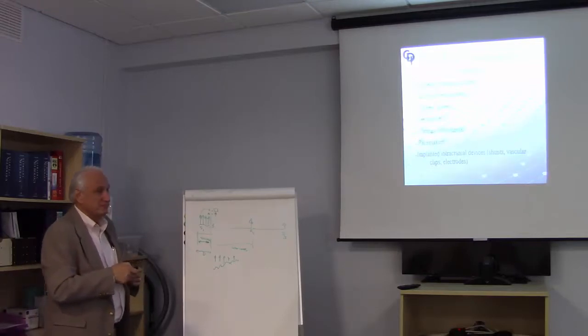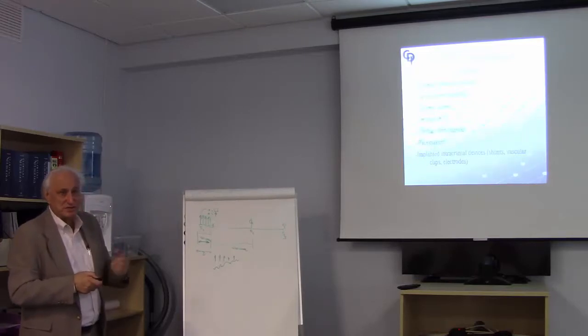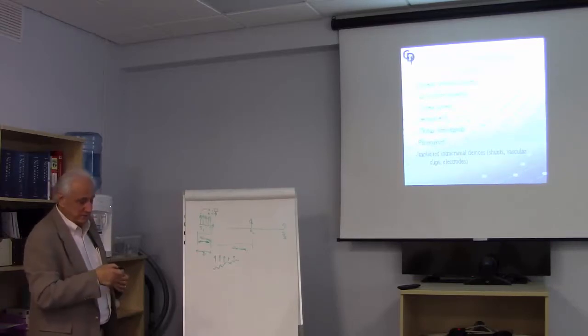I call these all relative because the decision about whether or not to use this technique, given these things as contraindications, is a joint decision on the part of the surgeon, the physiologist, and the anesthesiologist. And you want to avoid things.